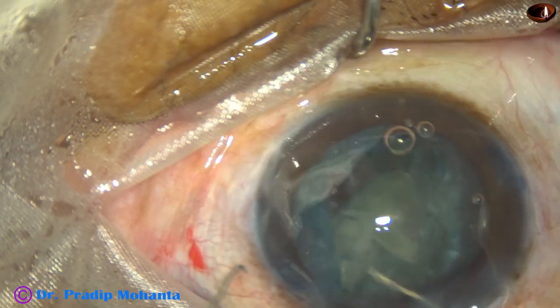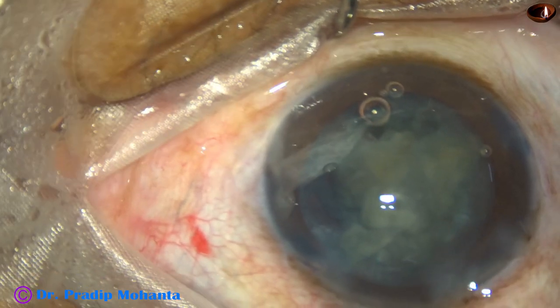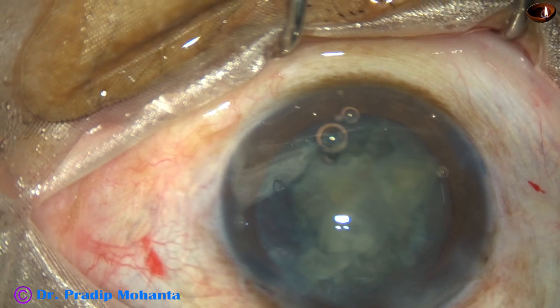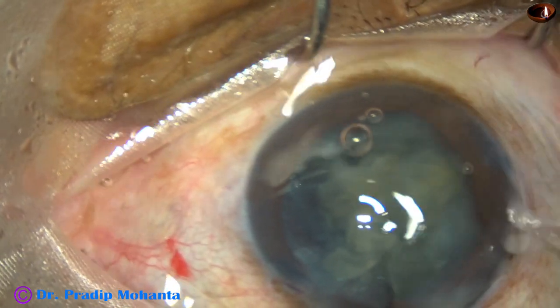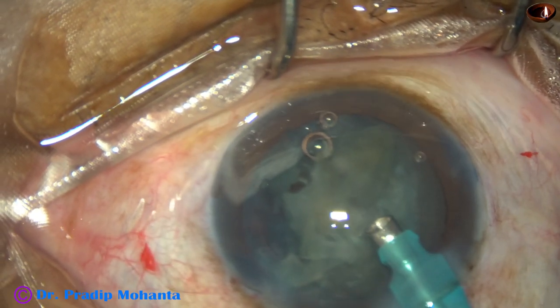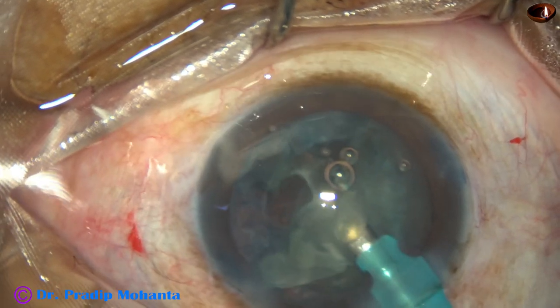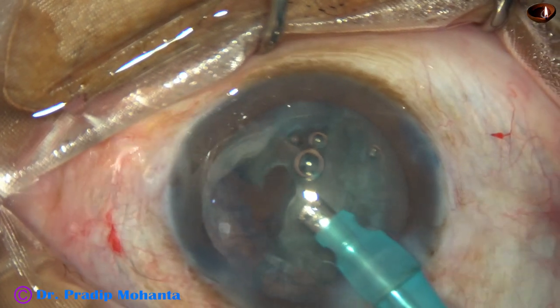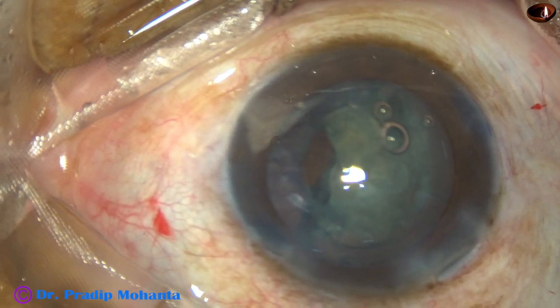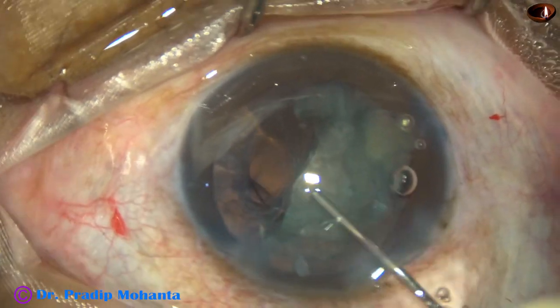What I do is I inject viscoelastic and use a hook to bring the pieces into the anterior chamber. At this time I was not sure whether there is a rupture or not. After bringing the pieces into the anterior chamber, I decreased the bottle height and tried to emulsify these pieces. I could bring the pieces out, but as I try to aspirate, the opening tends to enlarge — so I know that there is a rupture.